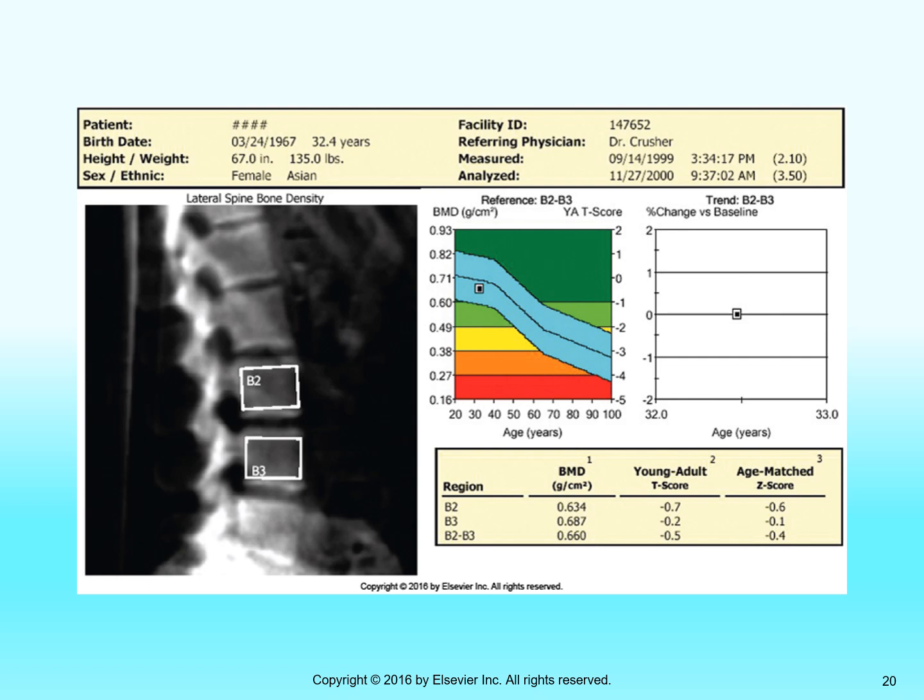And so it looks like this person is just below average, but they're not in any kind of danger zone. And you can see that the human population average bone density drops somewhere after age 40, and it falls at about a 45-degree slope until age 60, and then at about a 30-degree slope after age 60.